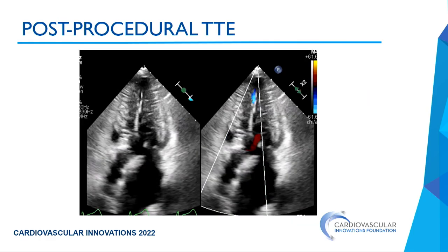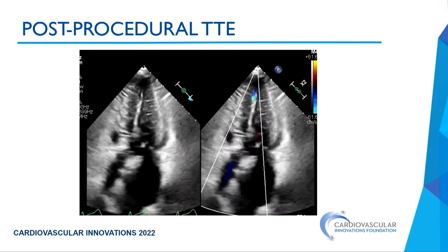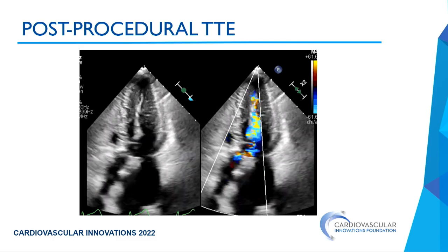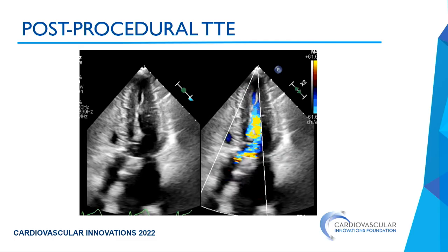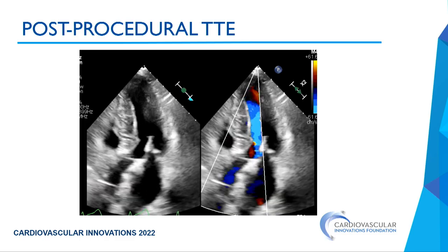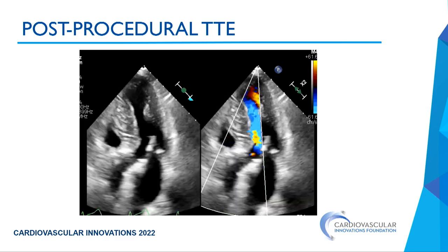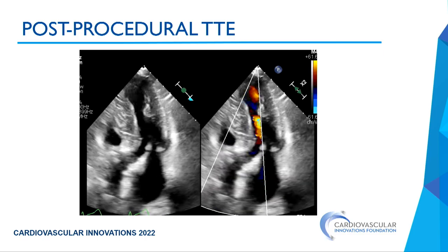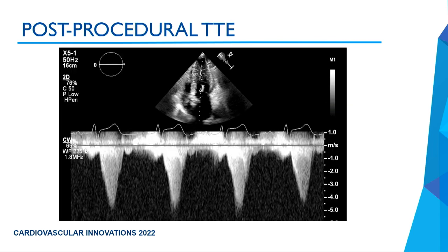This is her TTE immediately post-procedure, and there is less SAM, but you can see that her LV is severely hyperdynamic and is kind of collapsing on itself. This is in spite of the fact that we hydrated her substantially before the procedure, particularly with the induction of anesthesia. We were concerned that that was going to knock her into an arrest. Despite that, we still had substantially elevated velocities across the LVOT. Her aortic valve gradient was better, but she still has gradients up to 4 through the LVOT.